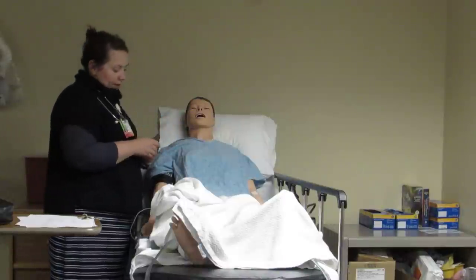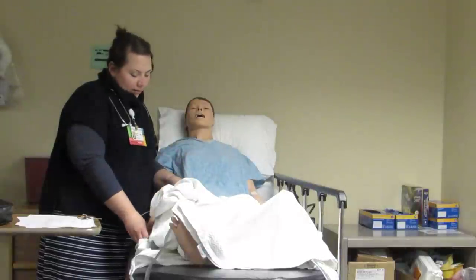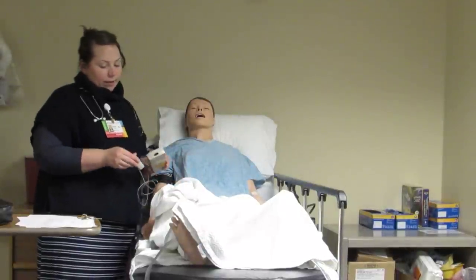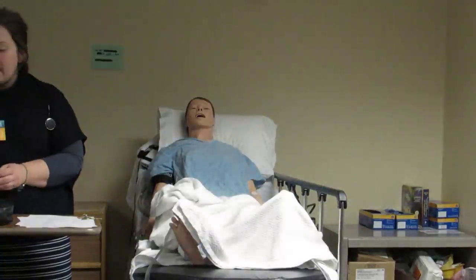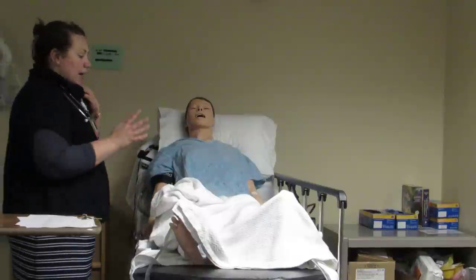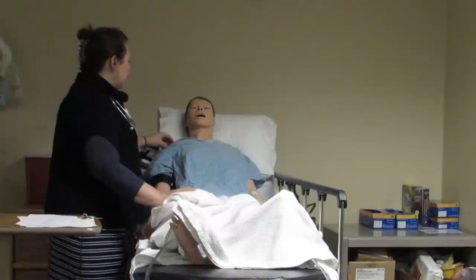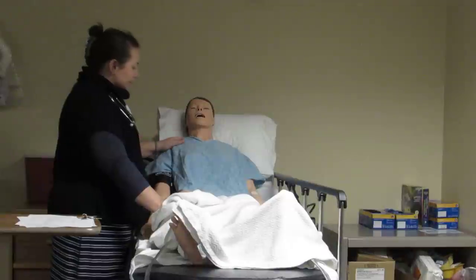Okay, Mrs. Smith, that looks good. Oxygen saturation now has a nice reading, and that is good. So I've completed a full set of vitals at this point, and now I'm going to go on to do my head-to-toe assessment. So Mrs. Smith, I'm going to take a listen to your lungs first.